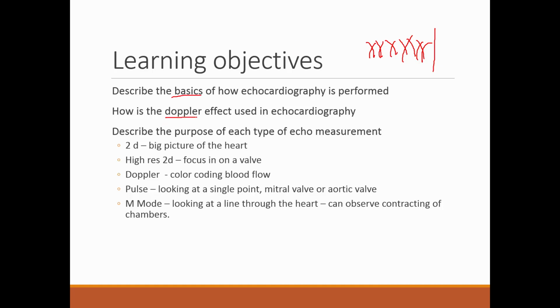One aspect of this is that we're using the Doppler effect. If you have red blood cells moving towards the probe, when you bounce the sound off of the probe, it's going to come back with a higher frequency. Or if the object's moving away, the sound is going to be reflected back with a lower frequency. So I think that's a big picture kind of thing.